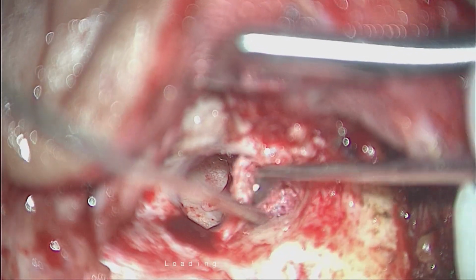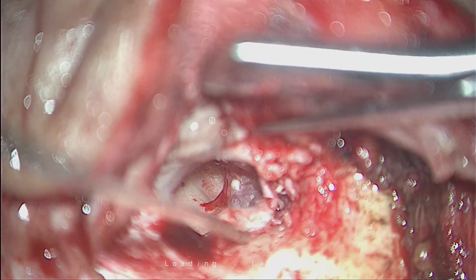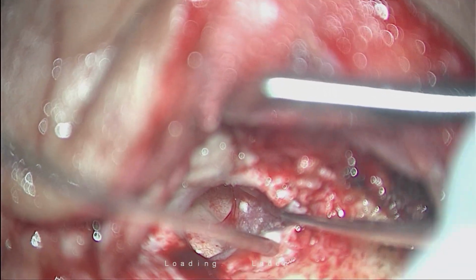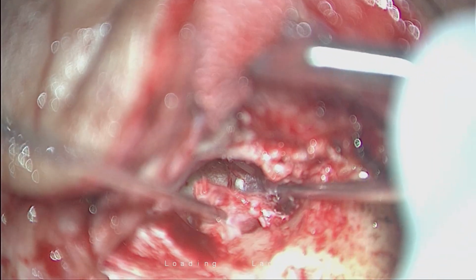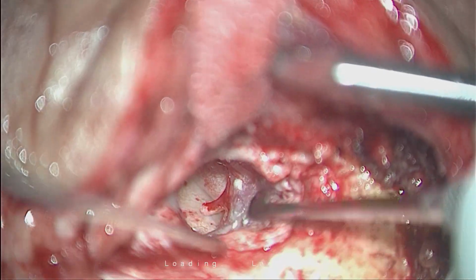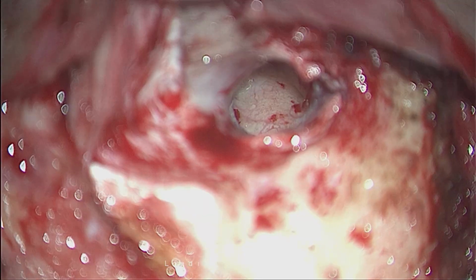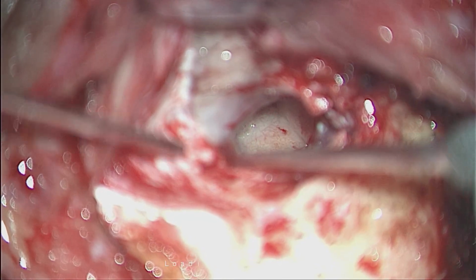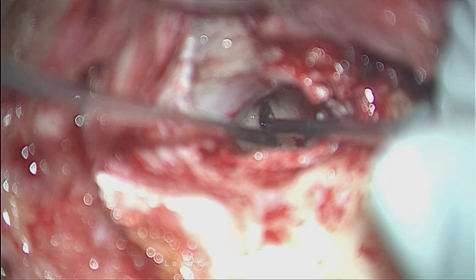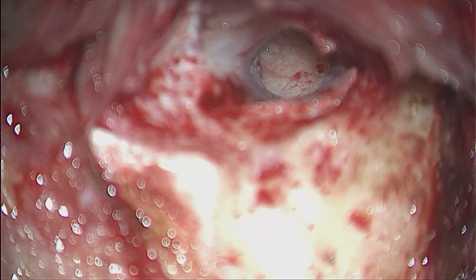And I can elevate a part of the tympanomeatal flap easily like this. This is superiorly. Same thing you have to do inferiorly, but the issue is I have to elevate this entire flap circumferentially. So ideally I should give an incision circumferentially like this. If I give an incision so laterally, I need to elevate the entire tympanomeatal flap down to the annulus, and handling that would be a little more cumbersome.